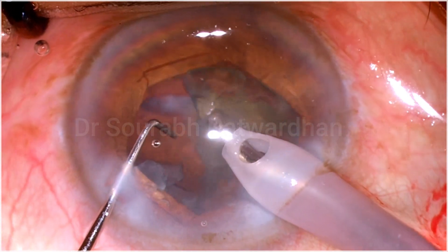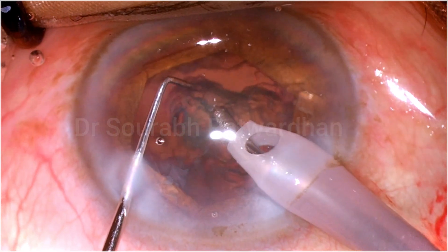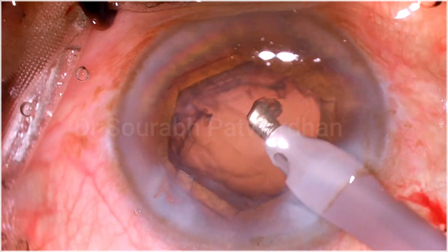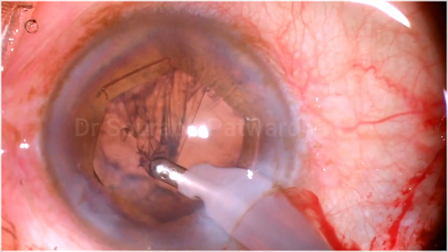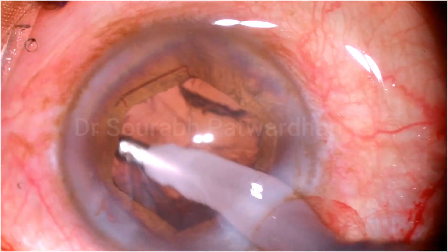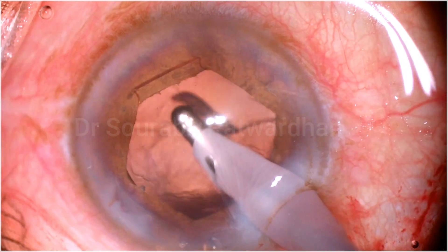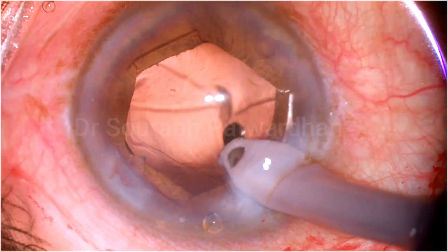I am using the Centurion Phaco machine which has active fluidics. I used 46 mmHg of IOP, and at the last piece the bottle ran out — it gives an indication that the bottle is over. I took this time to replenish the OVD, make the chamber deep again, and then go ahead. At this point I found that the iris was coming out from the left side port incision, so I decided not to use that incision if possible. During cortex aspiration as well, I just did single-handed coaxial IA. I didn't use the side port incision to stabilize the globe, to avoid any further damage from the prolapsed iris through the side port.